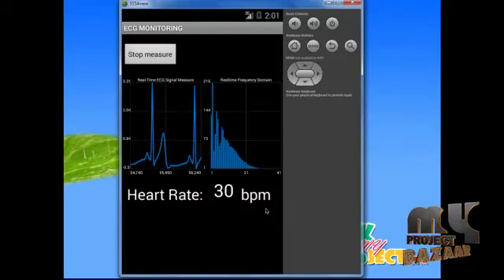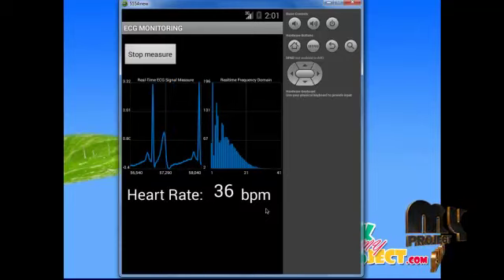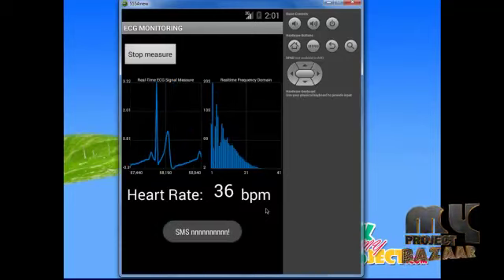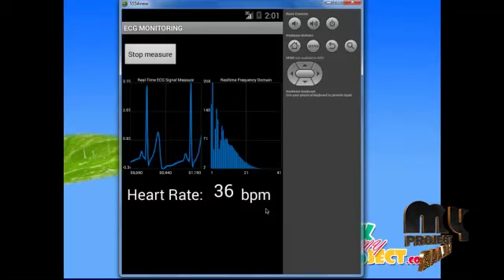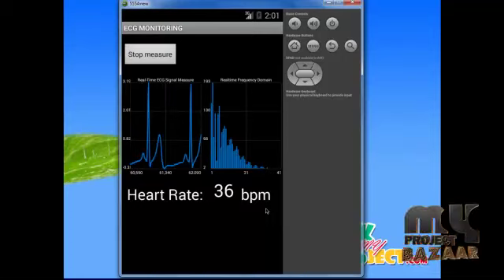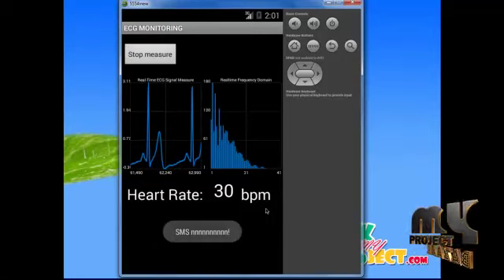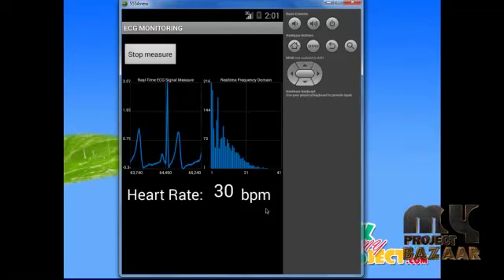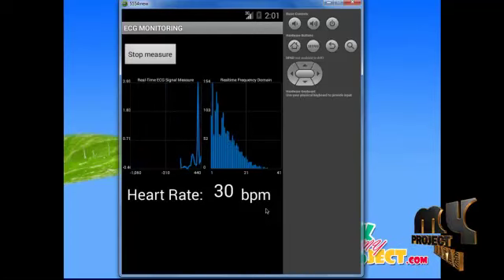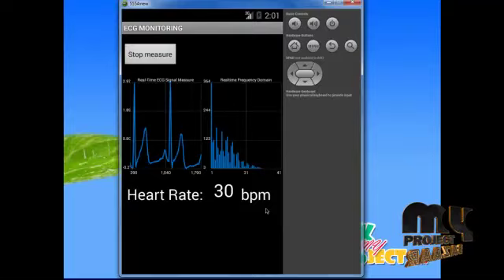So we propose a system which will continuously monitor the ECG of the subject based on the Android OS platform. This system can monitor and diagnose patient heart condition in real time with an ECG sensor and generate an alert whenever a deviation is found. This system will analyze the ECG wave and generate the proper error message, and also send the ECG signals if necessary to the clinic or doctor system.